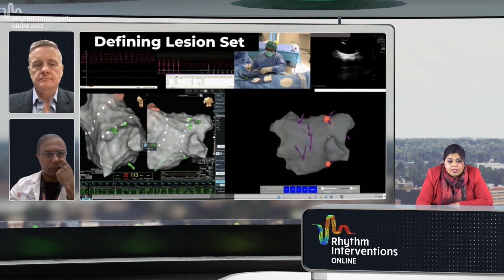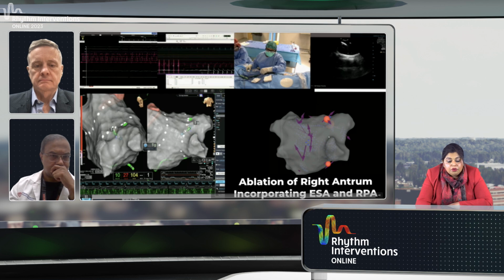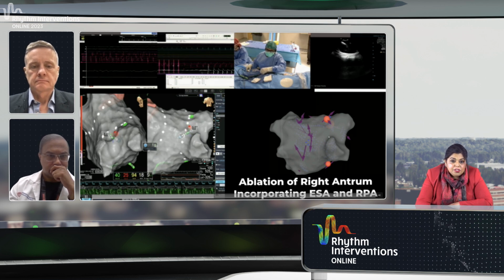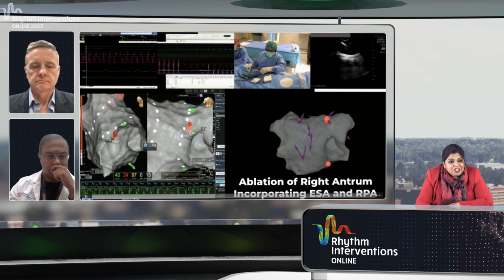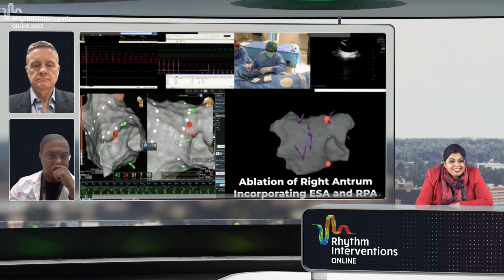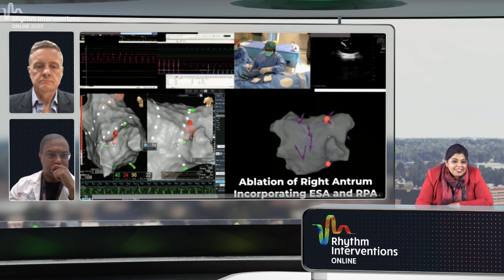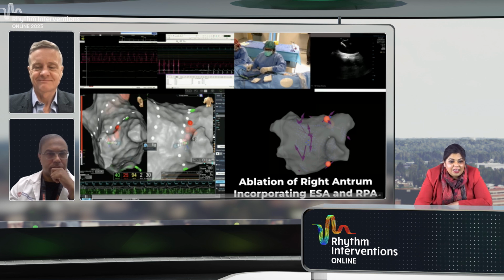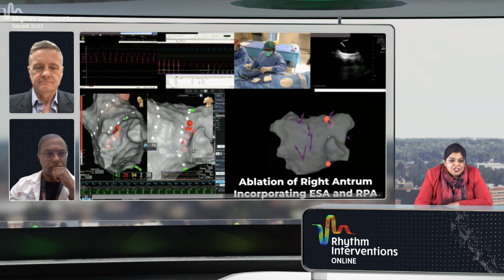And we're using a Tactiflex ablation catheter here. It's a single transeptal technique, and we had this discussion early on in today's sessions. I'm a single transeptal access person. I try to get my first pass isolation and then come back with the grid and check.